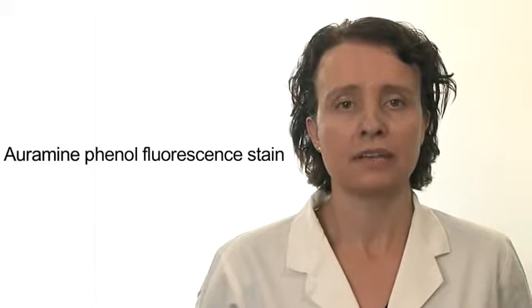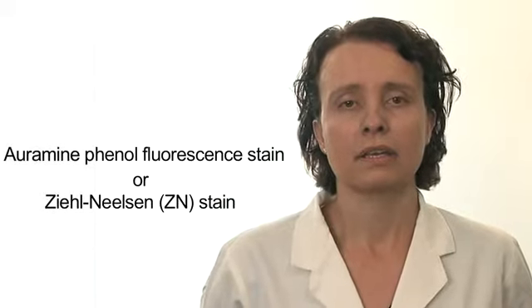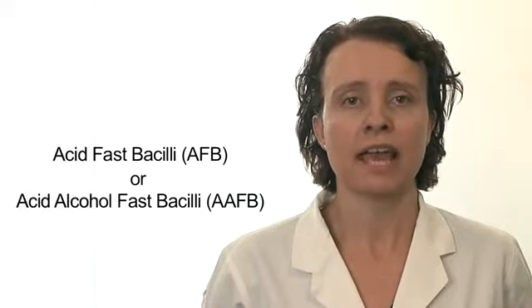The smear made from the decontaminated sputum deposit is stained by one of two methods: the auramine phenol fluorescent stain or the Ziehl-Neelsen ZN stain. The cell walls of mycobacteria contain a high concentration of lipids, making them waxy and hydrophobic and impermeable to routine stains such as the Gram stain. They are also resistant to acid and alcohol and are described as being acid-fast bacilli, AFB, or acid alcohol-fast bacilli, AAFB.